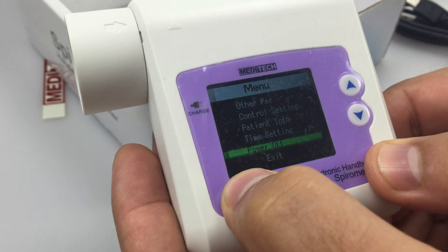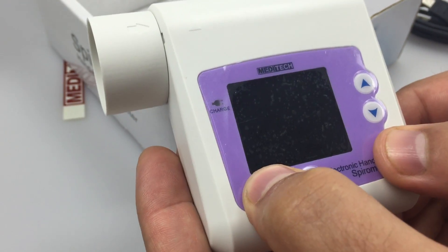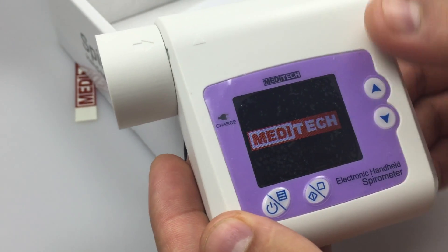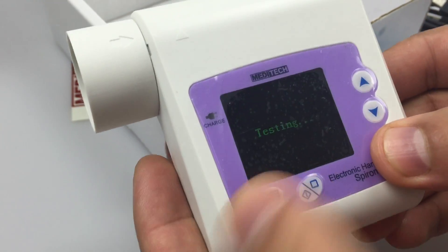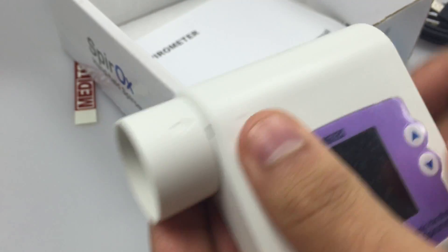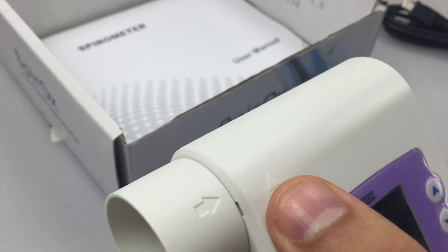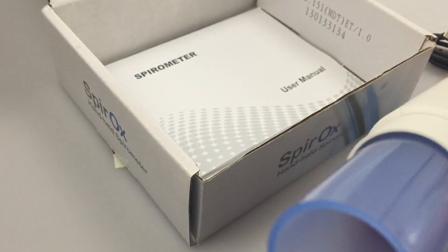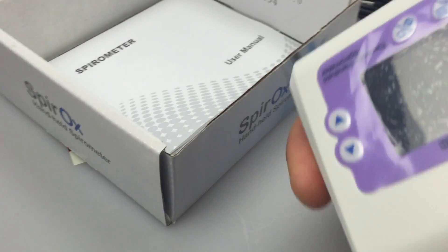If we want to use it without going to the menu, just go direct — we just need to open here. Then we will put the mouthpiece in.